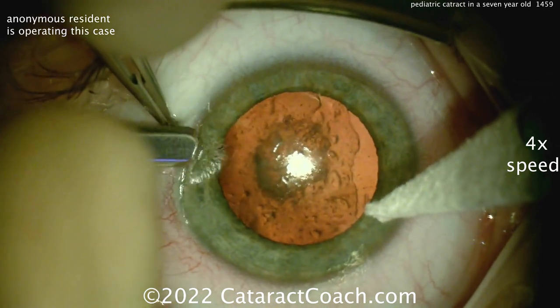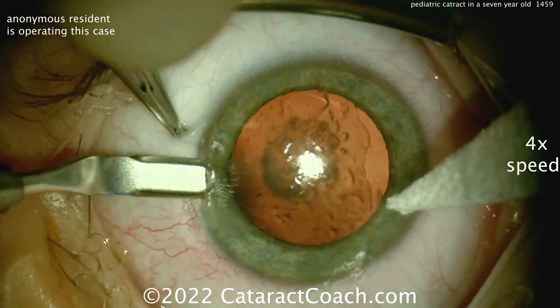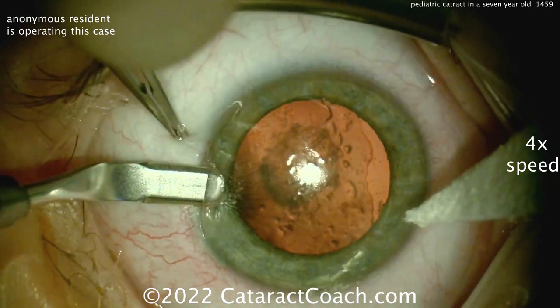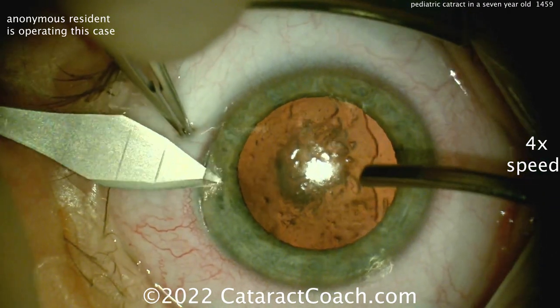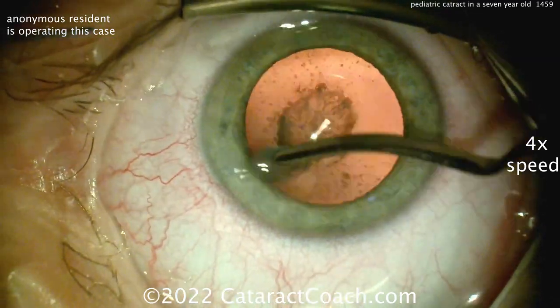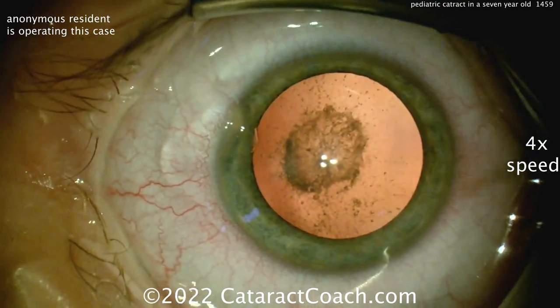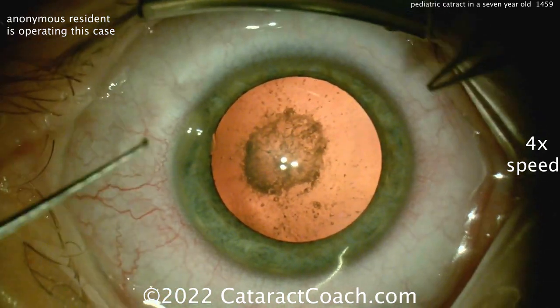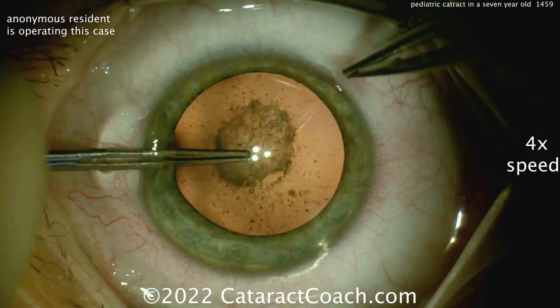Making an incision here temporally — interesting technique using a crescent blade to create a tunnel in the cornea instead of going right to a keratome. Now here we go with the keratome, and there's the incision. My suggestion in a case like this is to make the incisions really nick the limbal vessels, because it's really going to be much better for long-term healing for the patient.